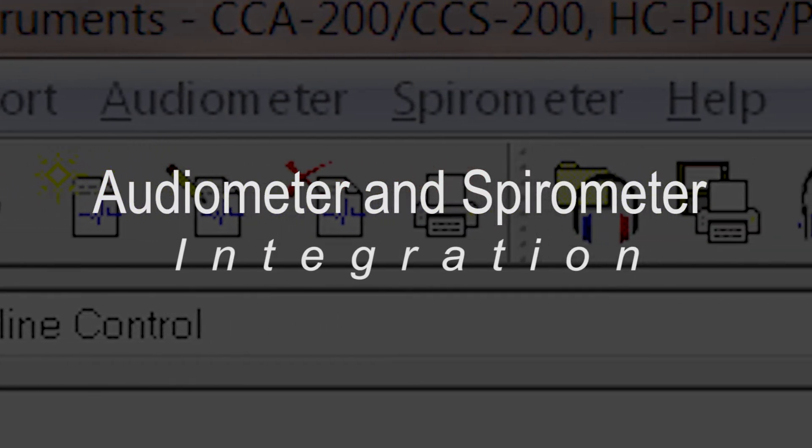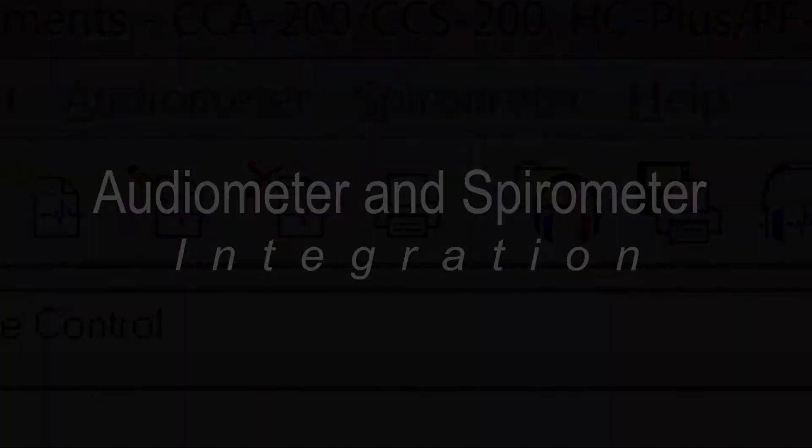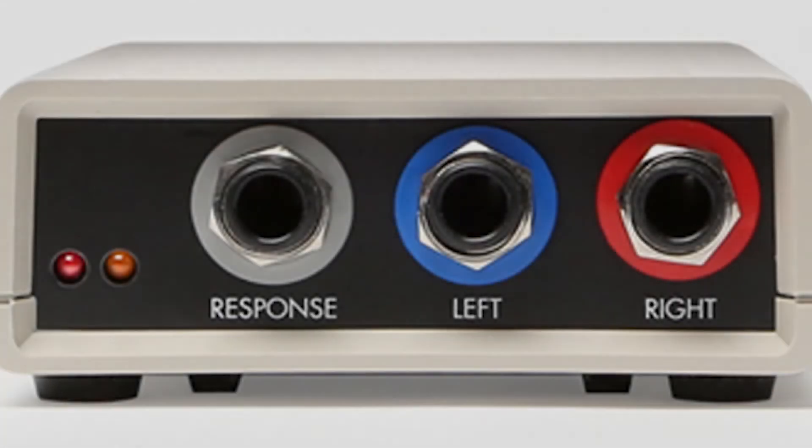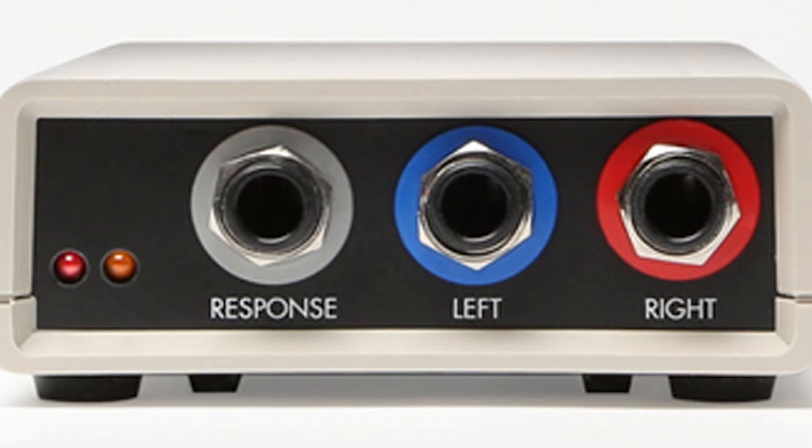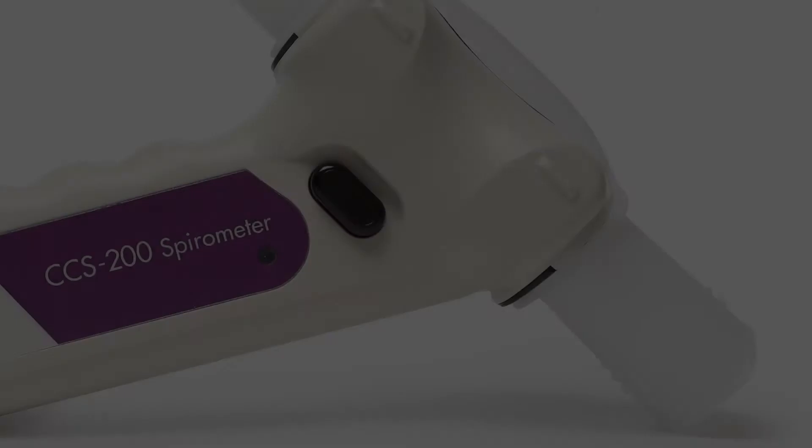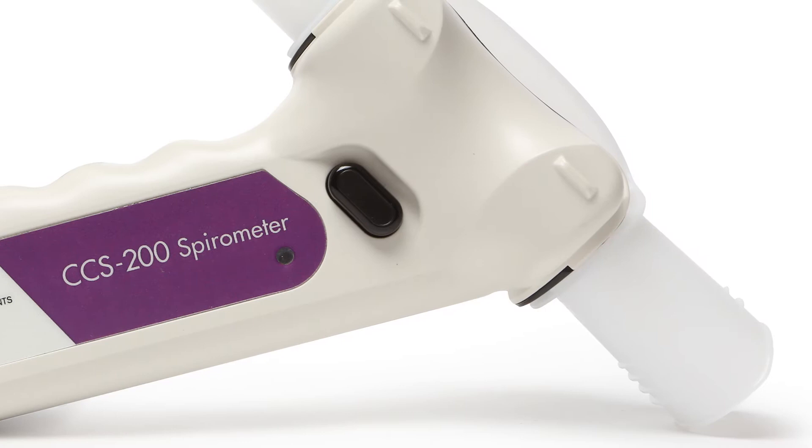Two of Benson Medical Instrument's popular products that are often used together are the CCA200 Mini Plus audiometer and the CCS200 Plus spirometer.